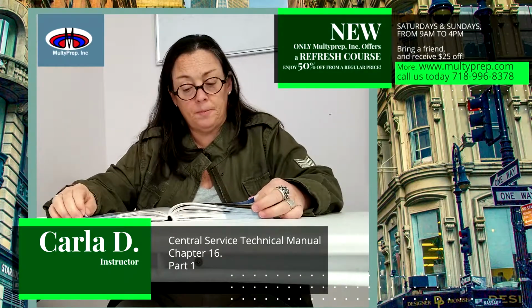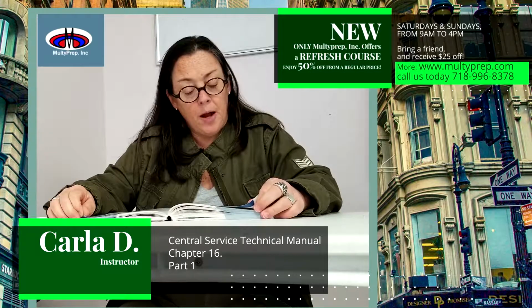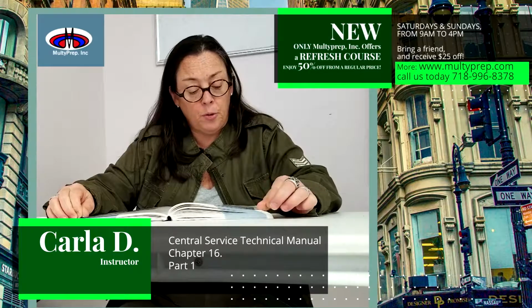Open shelving. In open shelf storage systems, items are placed on shelves that are not enclosed. Shelves usually have open racks to prevent dust accumulation. However, the bottom shelf must be solid to protect the stored items from contamination. Open shelving is convenient and less expensive than closed shelving. However, packages are more vulnerable to physical hazards, usually accidental, and environmental challenges from cleaning solutions and microorganisms.